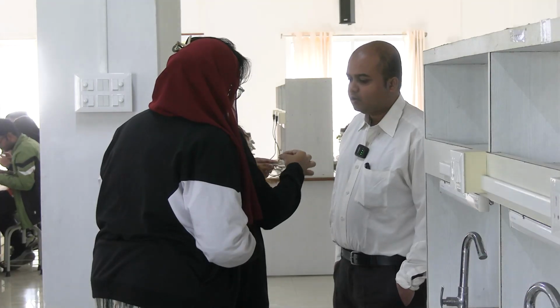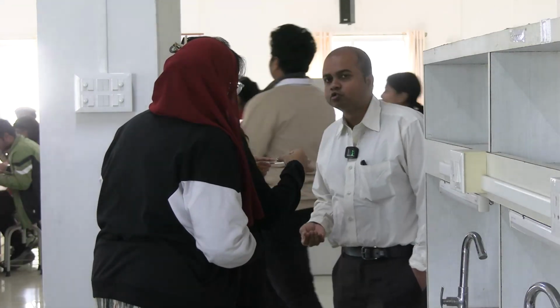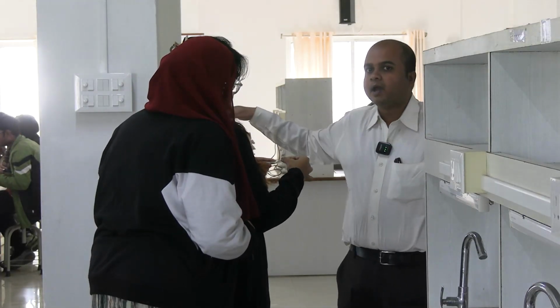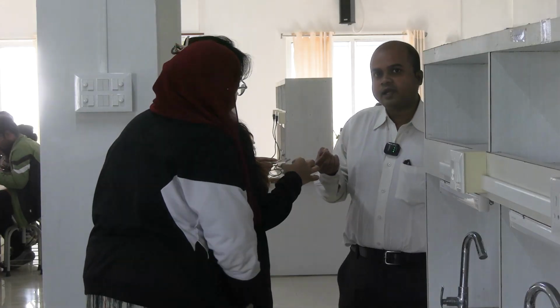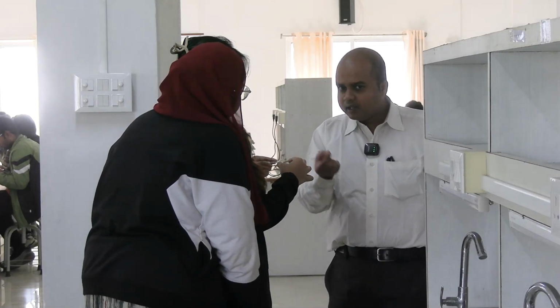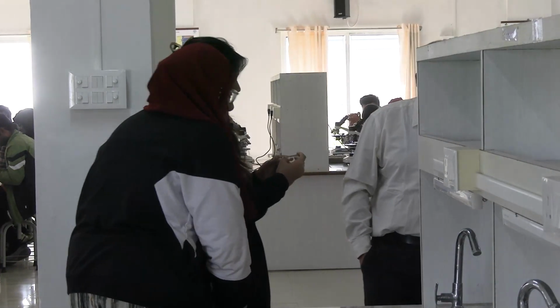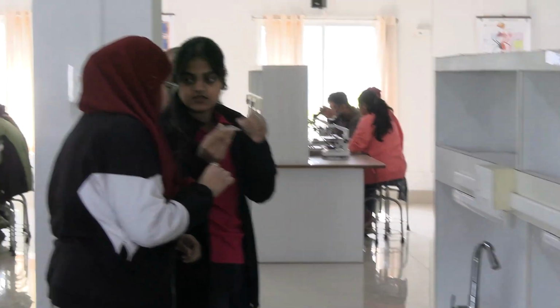The ideal is to apply the cover slip first, because if you apply blood first and then put the cover slip, the blood will spill. So, very carefully, after putting the cover slip, you have to put the blood with the pipette in that small gap. The lab technician will help you.